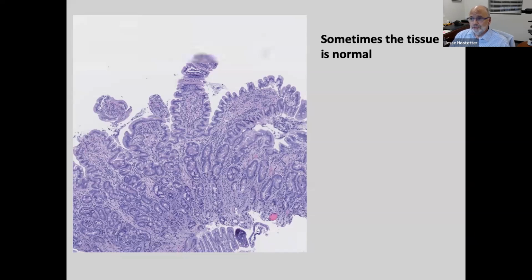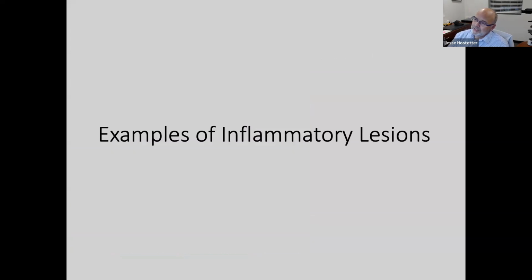We all know as veterinarians what the differential list for vomiting and diarrhea looks like. It's huge, and not all those causes are from the GI tract. I think it's powerful information if we say that in the colon, in the duodenum, and in the stomach, we don't see any evidence that would support intestinal disease. That doesn't mean it's not there, but you may also want to go and look at some of your other differentials as well. So keep that in mind as you look at these. All right, let's go through a few examples. I have talked a lot.